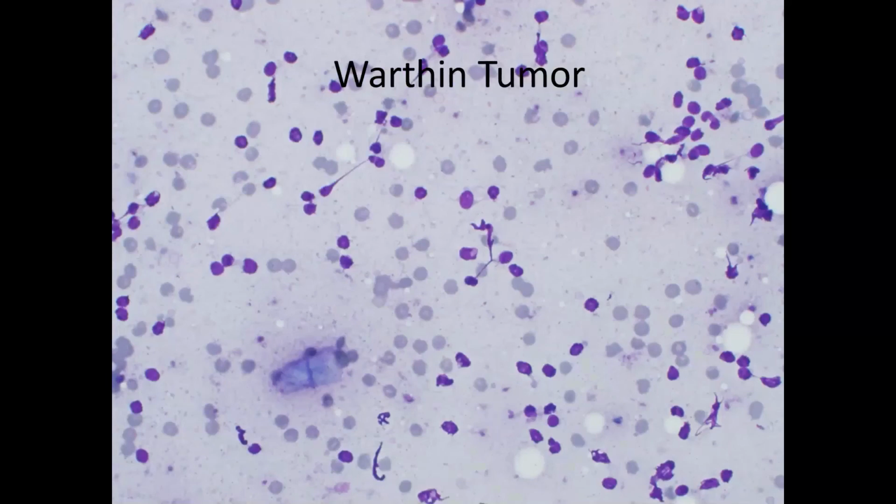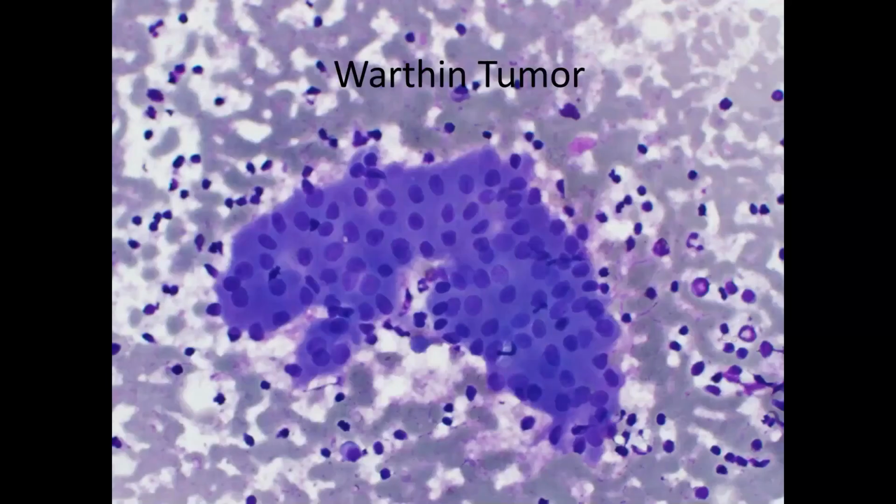But again, the most important thing for me is that the epithelial component of the aspirate should be entirely comprised of flat sheets. These Warthin's tumors essentially always look the same for my money. You just get these three components to varying degrees. But the epithelial component is the most important. And again, flat sheets, relatively evenly spaced out, with abundant granular cytoplasm, as well as bland nuclei and nucleoli. And again, these groups are punctuated by little lymphocytes as well.